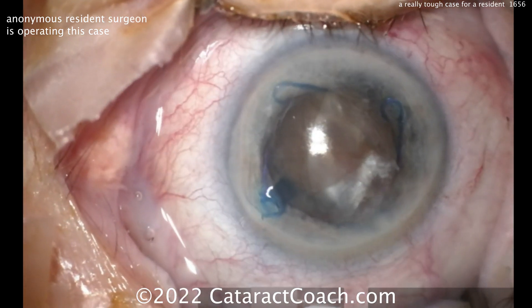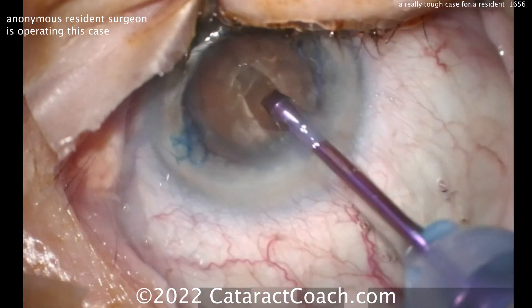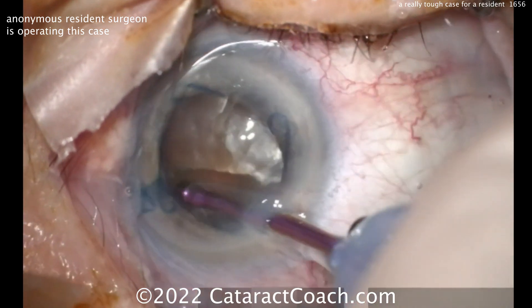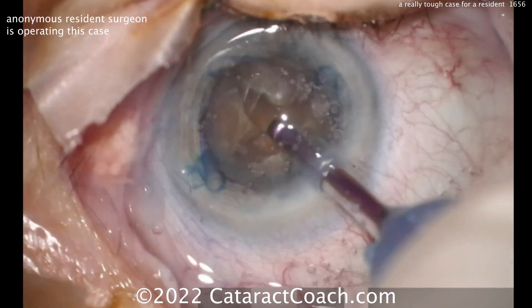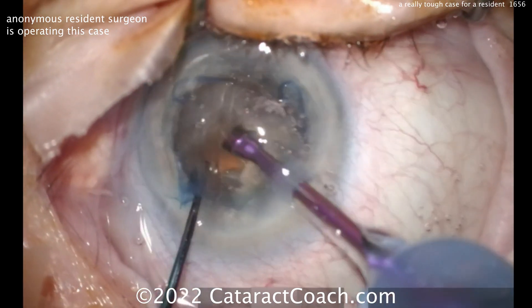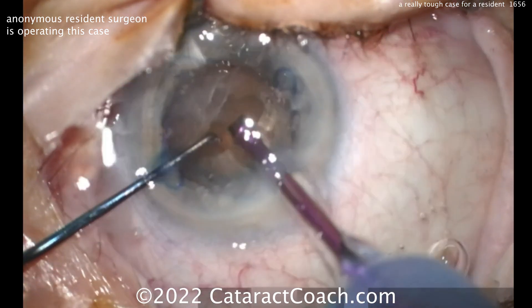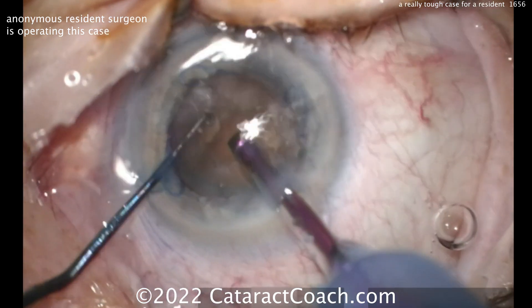But be cautious. Looks like that was just some cortical material that came out, not prolapse from the nucleus. Zonular support can be very weak. We have a whole series on nonagenarians — meaning patients who are 90 years plus. The tissues are not the same, so you should watch that. Go to CataractCoach.com and search for the word nonagenarian. It looks like a divide and conquer technique here.